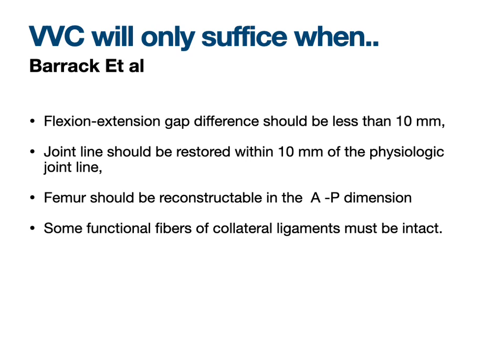The varus-valgus constraint will only suffice when the flexion extension mismatch is less than 10 millimeters, the joint line is restored within 10 millimeters of the physiological joint line, the femur is reconstructible in the anteroposterior dimension, and there is at least some functionality remaining in the collateral ligament.